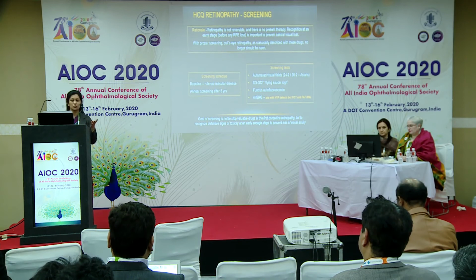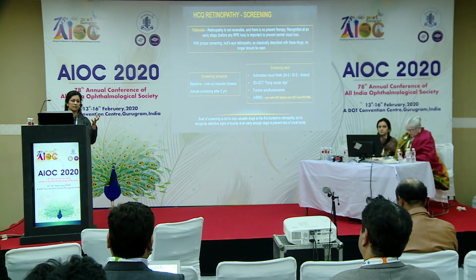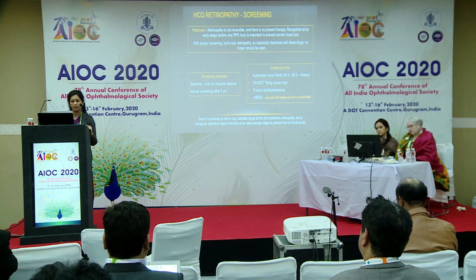So at least it should be repeatable and it should be progressive, because these are very useful, cheap and effective drugs for the patient. So many a times we see that just slight abnormality on multifocal ERG or OCT and the patient is asked to stop the drug. That is not recommended.